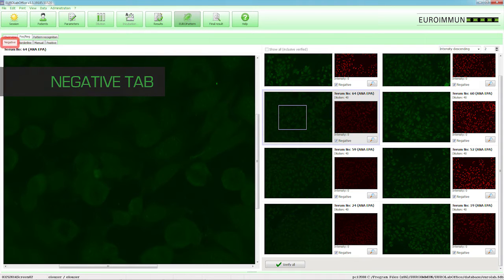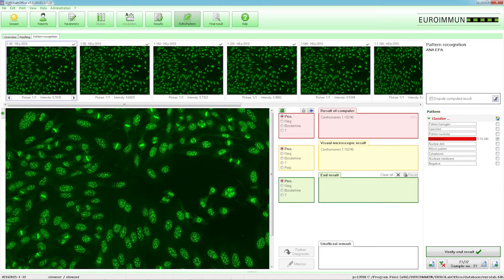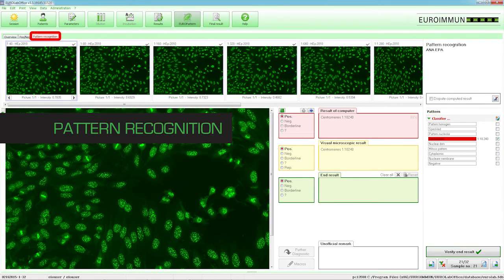In the Negative tab, click Verify All to release all of the negatives with a single click of the mouse. Samples in the positive batch are to be viewed in more detail via pattern recognition.